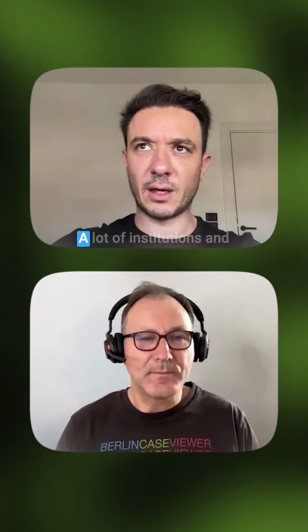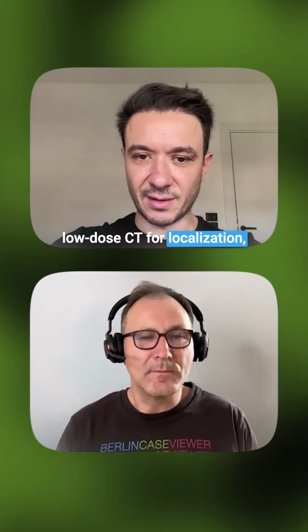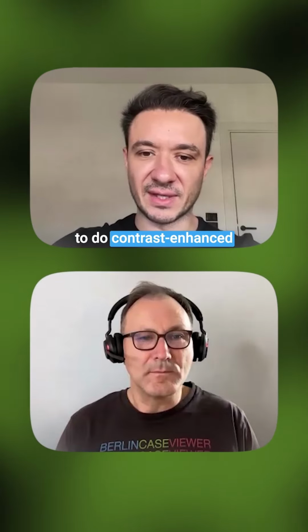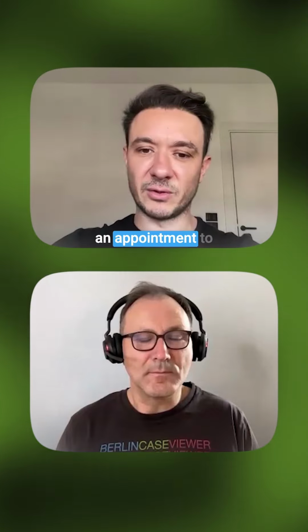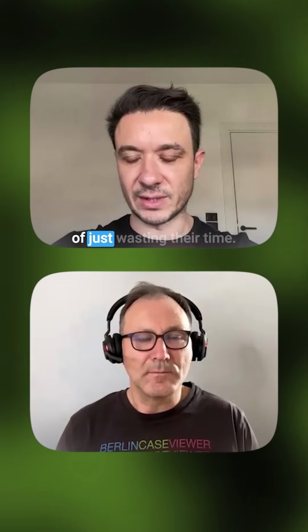Yeah. A lot of institutions and centers, especially in this region, just do a low dose CT for localization, and you end up with these findings that you don't know how to describe. They would just recommend contrast-enhanced CT or MR, and that's going to delay the patient's treatment. You're going to need an appointment to do different imaging. So instead of all that, you can actually describe or tell the referring physician what is going on with these patients instead of just wasting their time.